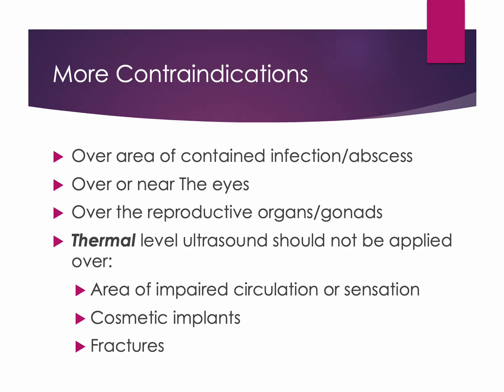Finally, thermal ultrasound should generally not be applied over acute fractures. Excessive heating at the fracture site could potentially disrupt the healing environment or aggravate inflammation in the early stages of repair. While low-intensity pulsed ultrasound has historically been investigated for fracture healing through non-thermal mechanisms, this differs significantly from thermal ultrasound used to create deep tissue heating. As always, patient screening, clinical reasoning, and proper parameter selection are essential before applying therapeutic ultrasound.